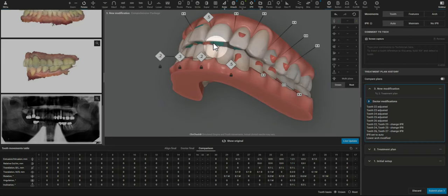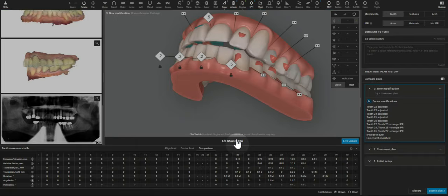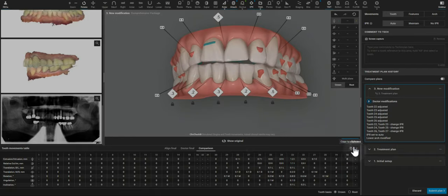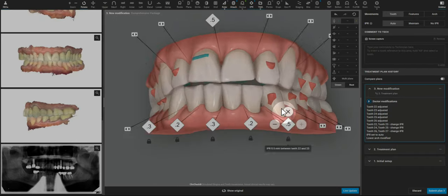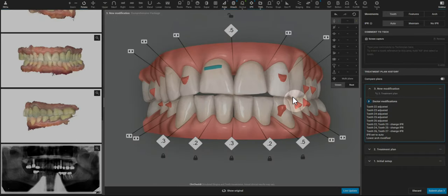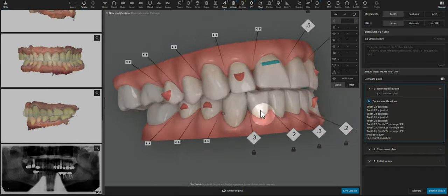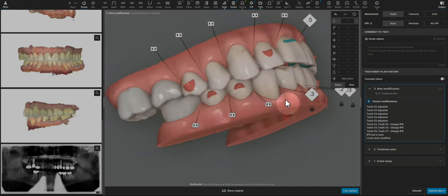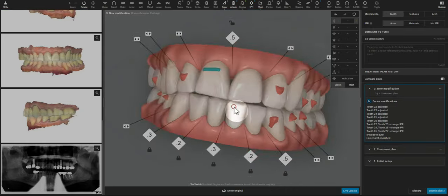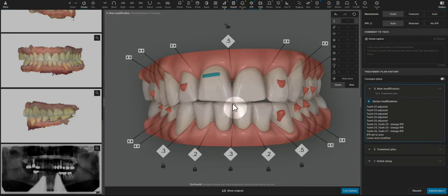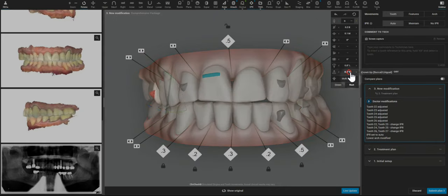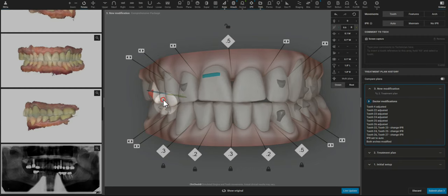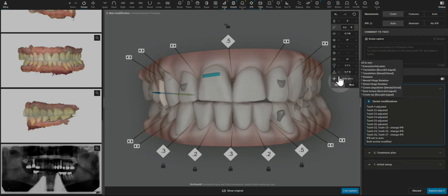I generally like to see at least a millimeter visual space between the upper and lower arches when there's a deep bite. And I'm really not shy about how much interoclusal space because I have yet to create too much where it became a problem, as intrusion is always one of those movements that lags behind.